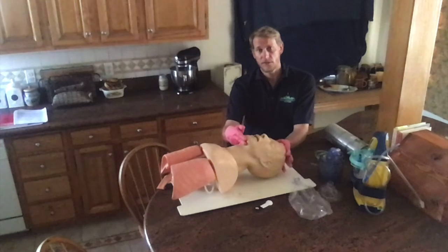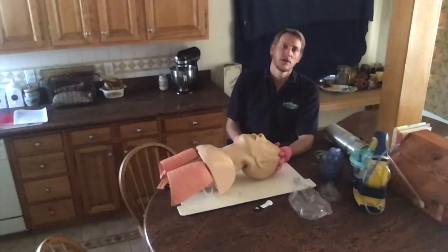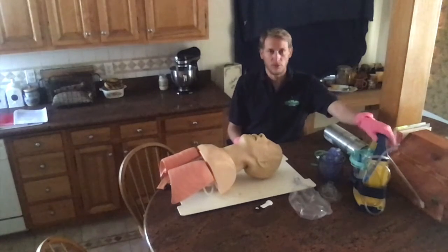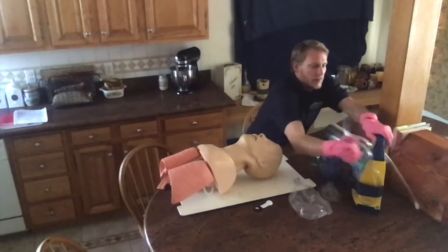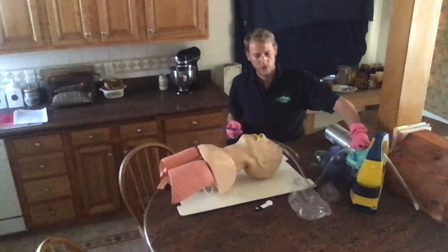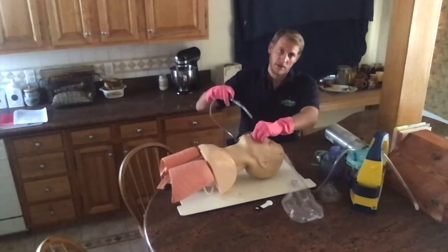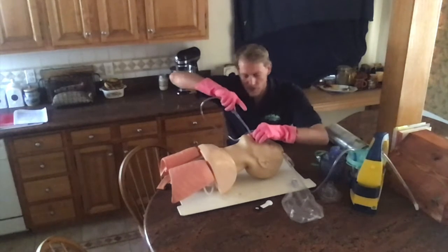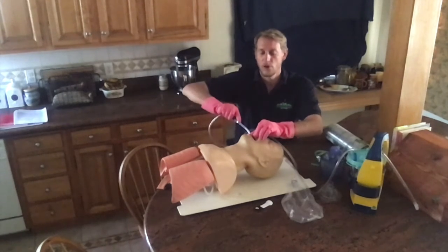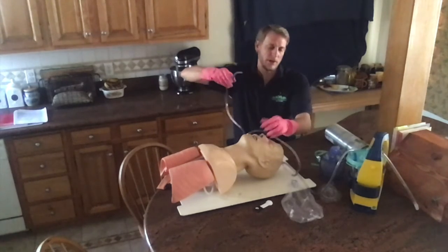I'm going to use the head-tilt chin-lift to open the patient's airway and look inside. It looks like the mouth and oropharynx are full of vomitus and secretion, so I'll prepare my rigid suction catheter. I'll grab the tube and catheter, turn on the device, open the airway manually, insert the catheter without suction, then apply suction in a sweeping motion — no more than 15 seconds — towards the front of the mouth to clear out the secretions.